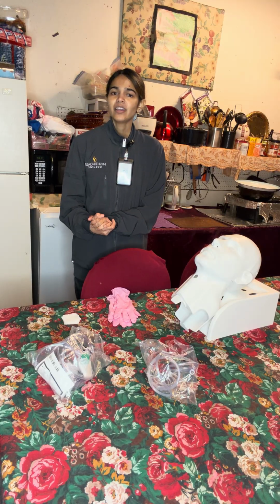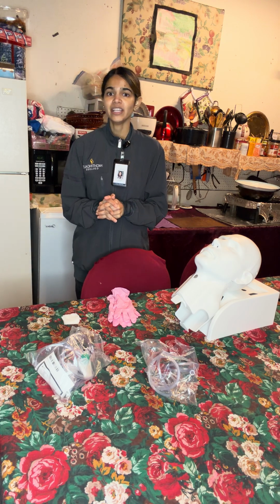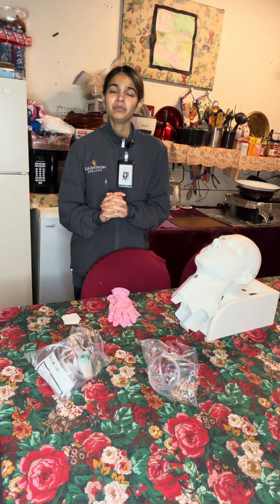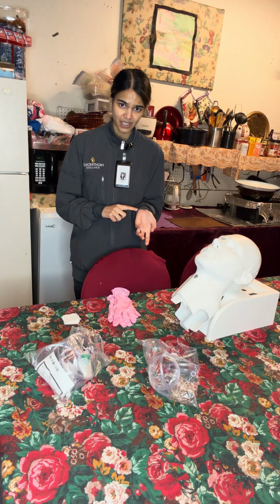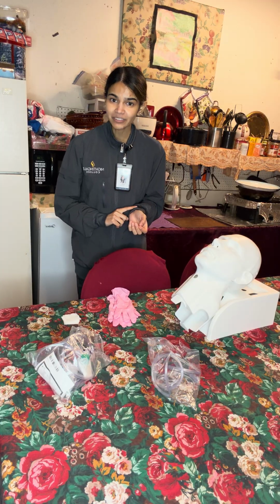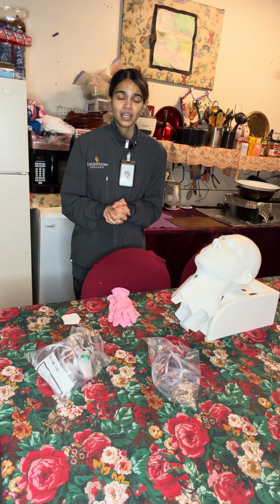Then I will identify the patient's identity using two key identifiers. May you please verify your name and date of birth, in which the patient will respond, name being Stephanie Rodriguez and date of birth being 2/15/1971. And I can confirm the identity using their wristlet that has their information. Once patient identity has been confirmed, I will then explain to the patient what the doctor has ordered and what procedure will be completed.